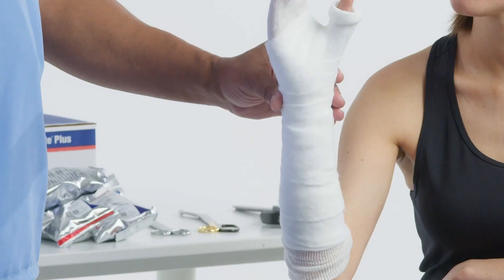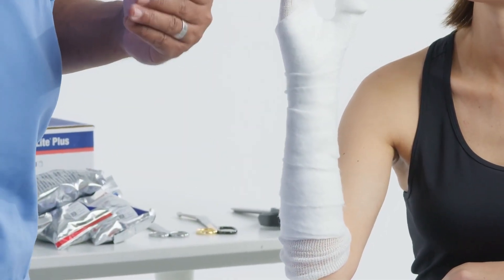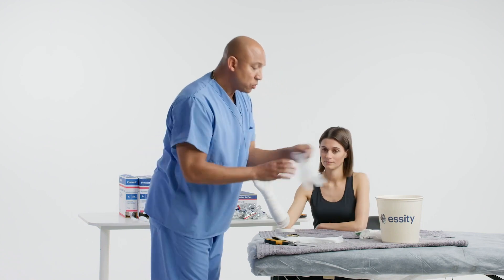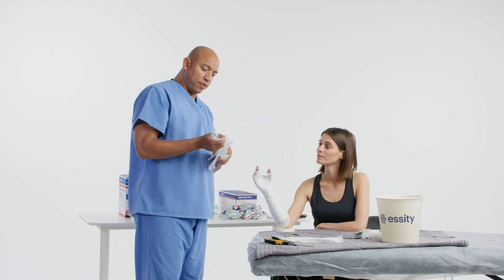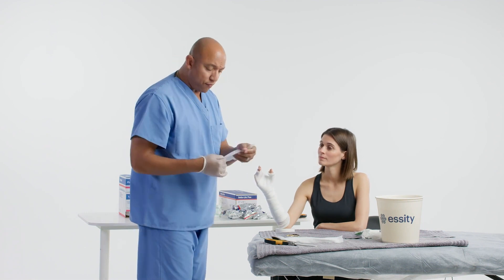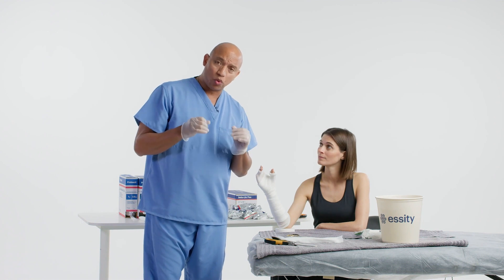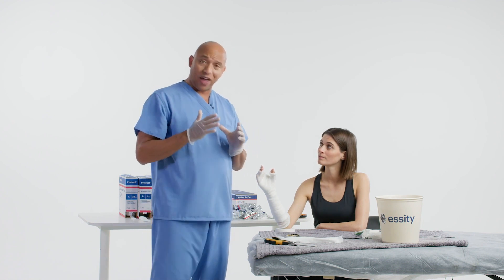Now I'm going to check the bony prominences, look it over for any shadows or thinness of padding, and now we're ready to apply our cast tape. I'll throw some gloves on. You can use two-inch or three-inch cast tape — that's going to be your preference. The big thing is ensuring you get it on fast enough while the cast tape is really soft so you can start to laminate it and make it set.